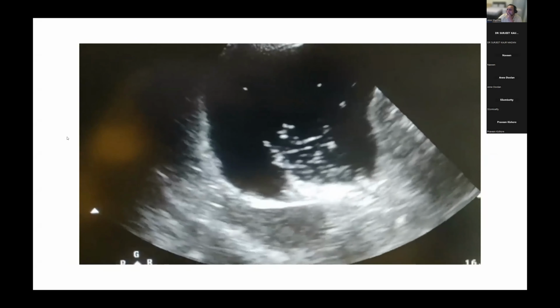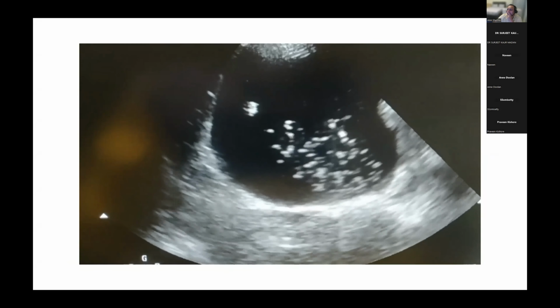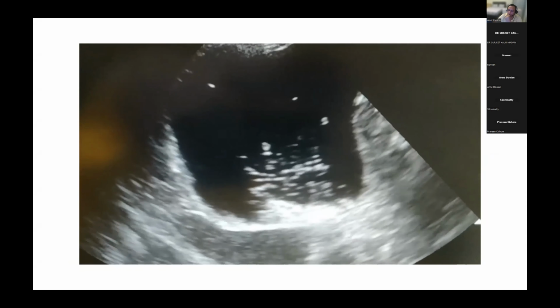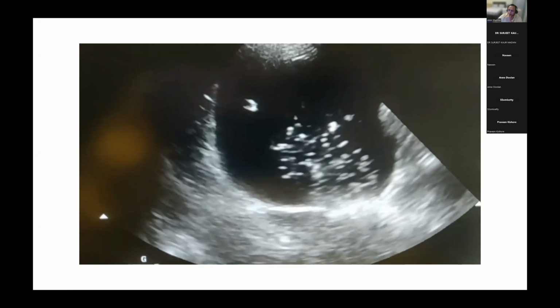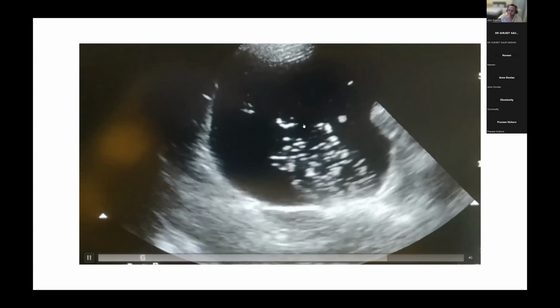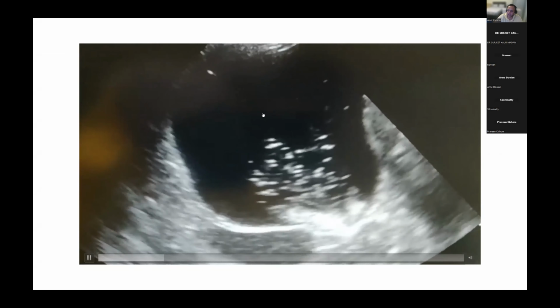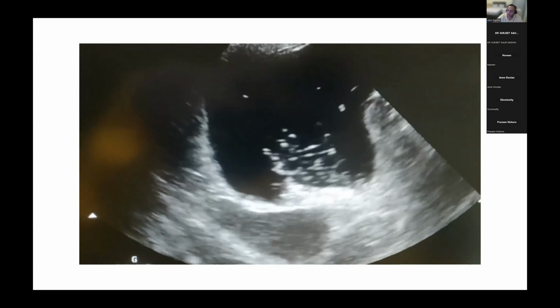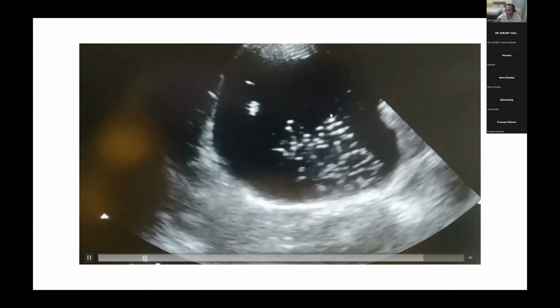So, there is debris, quite a bit of debris. The question is, is that blood in there? And also the top end, is that a bit of lung, possibly lung tissue? Again, there's a difference between debris, RBCs, and acute bleeding. If it was acute bleeding and this was fluid, what would fluid be? Anechoic or echoic?